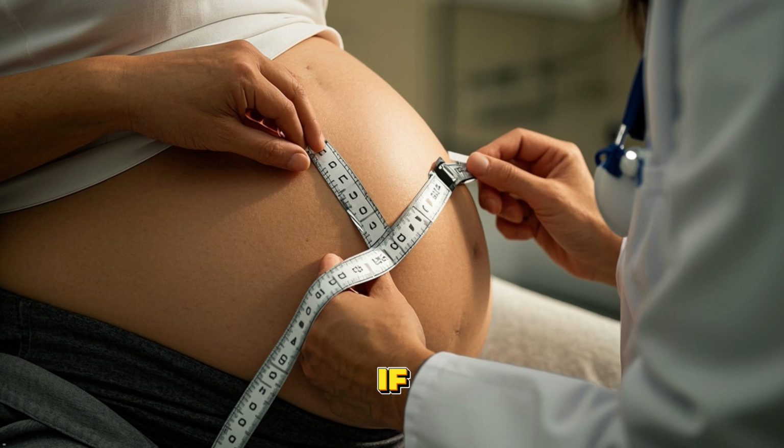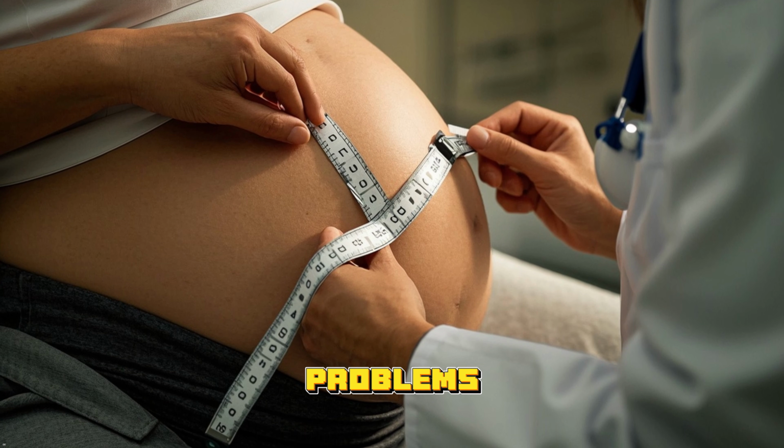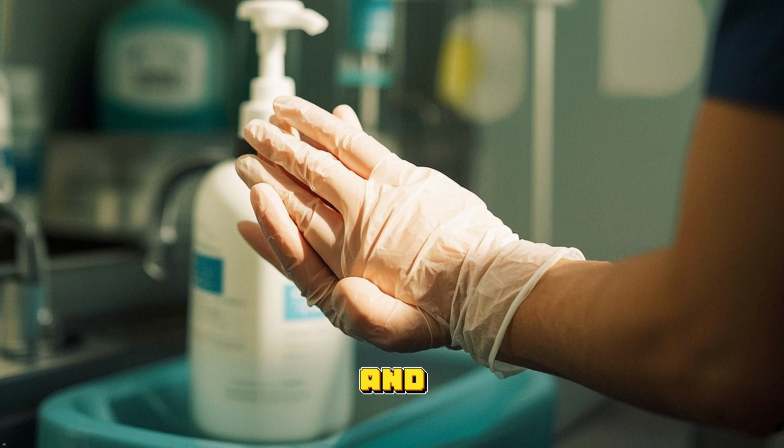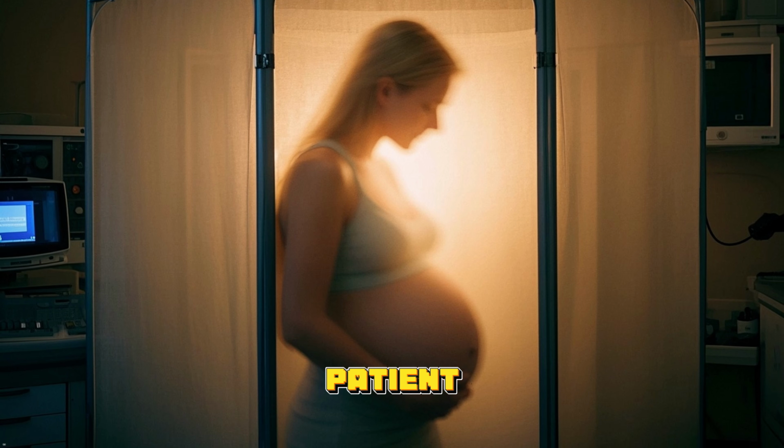It's easy to do, but if not done correctly, you can get an inaccurate reading which could lead to potential problems. So make sure that you wash your hands and put on a clean pair of gloves. You need to ensure patient privacy by draping the patient appropriately.